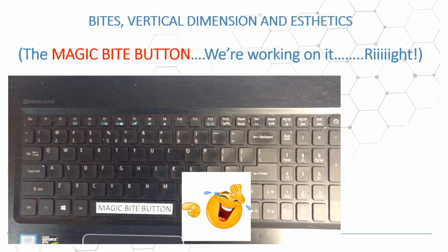You know, as you'll see coming up, we'll get cases in here that have 1 centric stop, that have 2 centric stops, that have no posterior teeth, just anterior teeth, and we're asked to make single arch or double arch, full arch restorations to put into the time of surgery and have the bite correct. Well, we just can't guarantee that. So those are the kind of things we address here, and the kind of things that we get that don't have the bites necessary for us to know that this case is going to work.